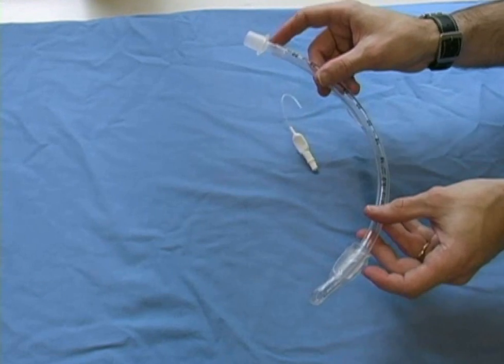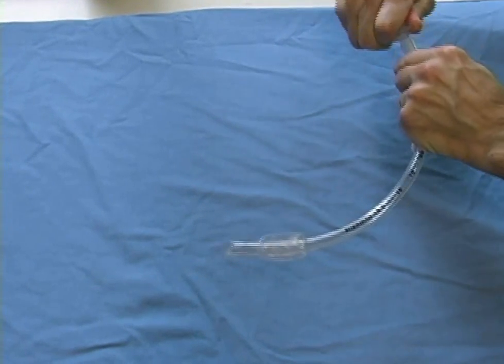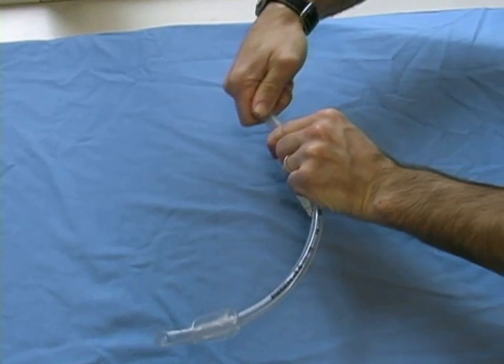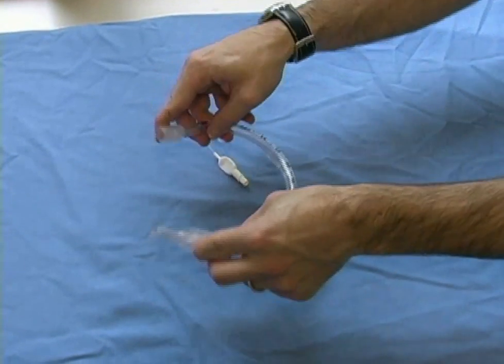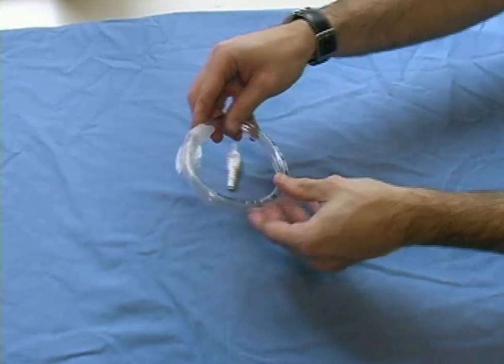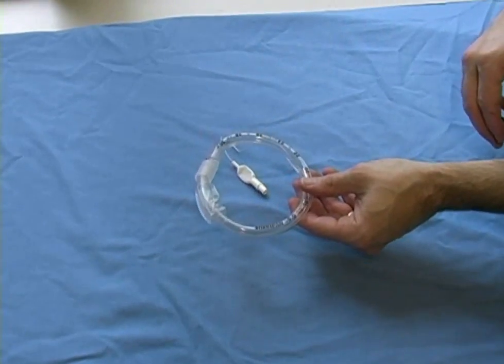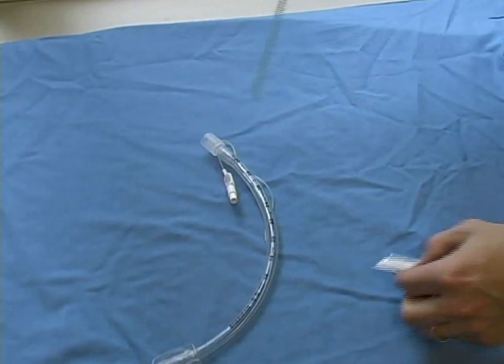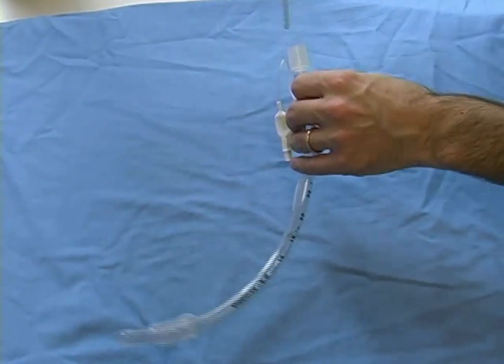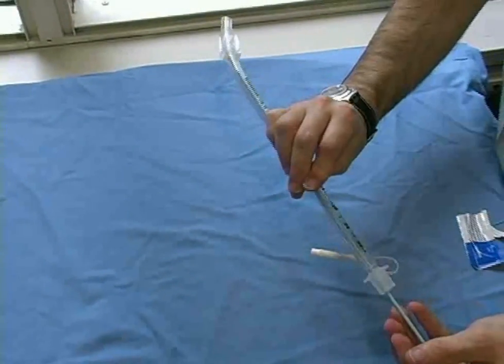To prepare your endotracheal tube for intubation, secure the connector in place. If you do not plan to use a stylet, you can bend the tube in the form of a circle. Although curving the tube is not mandatory, some practitioners recommend this step because it can facilitate tube placement through the vocal cords. If you choose to use a stylet, it should be lubricated with Surgilube and placed inside the endotracheal tube.